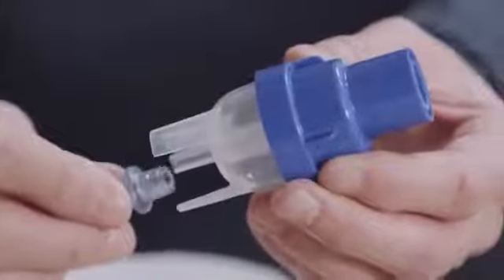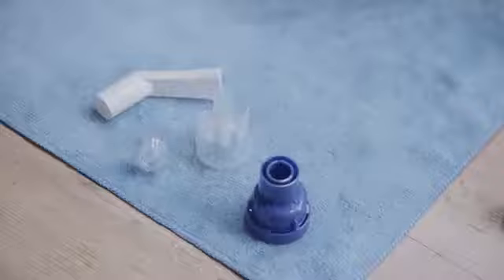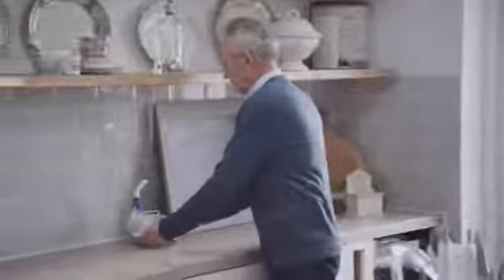Disconnect tubing from the medicine cup and wash all items, apart from the tubing, in hot soapy water. Rinse all parts in clean water for 2 minutes. Shake off excess water and allow to air dry. Do not towel dry. Reassemble and store the SideStream in a clean place when not in use.